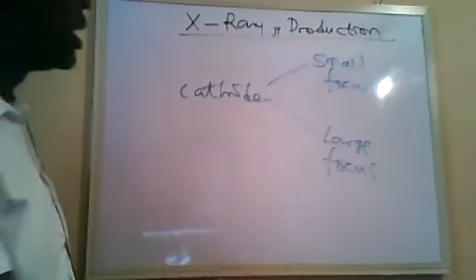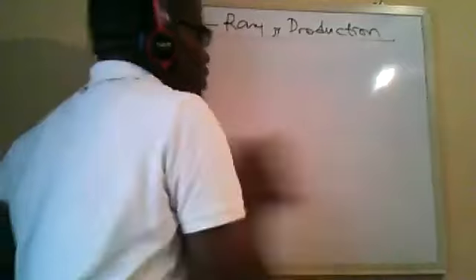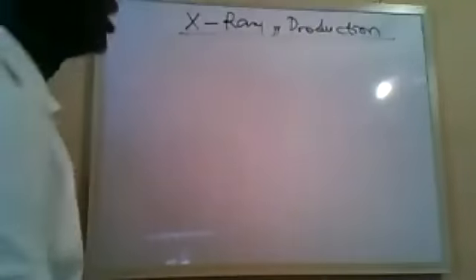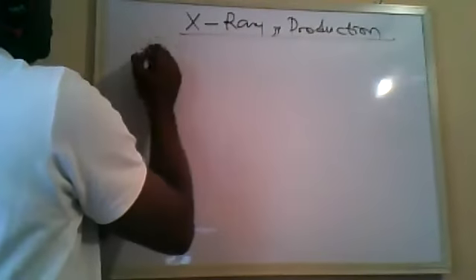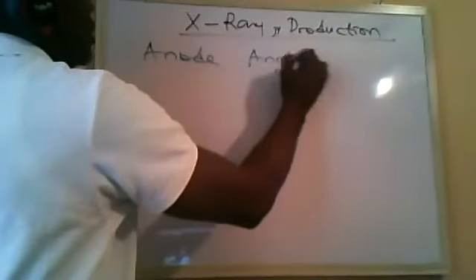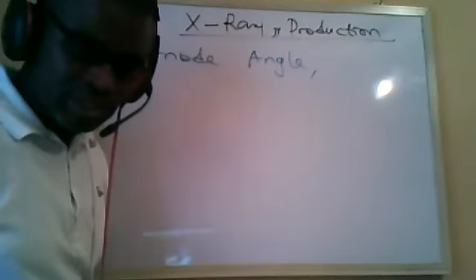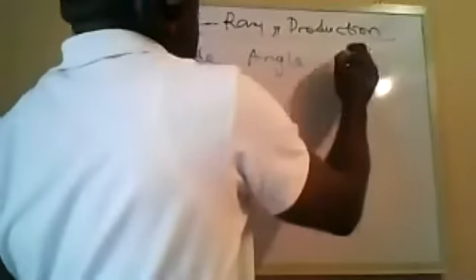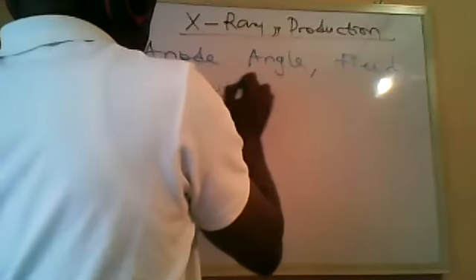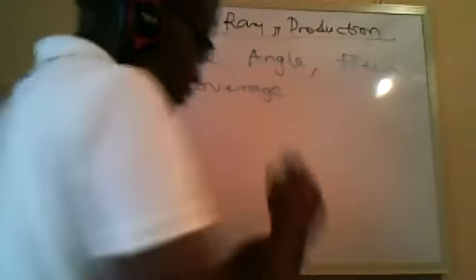I will get to know all this later as we move into the next one, which is the anode angle. The anode angle defines the field coverage.